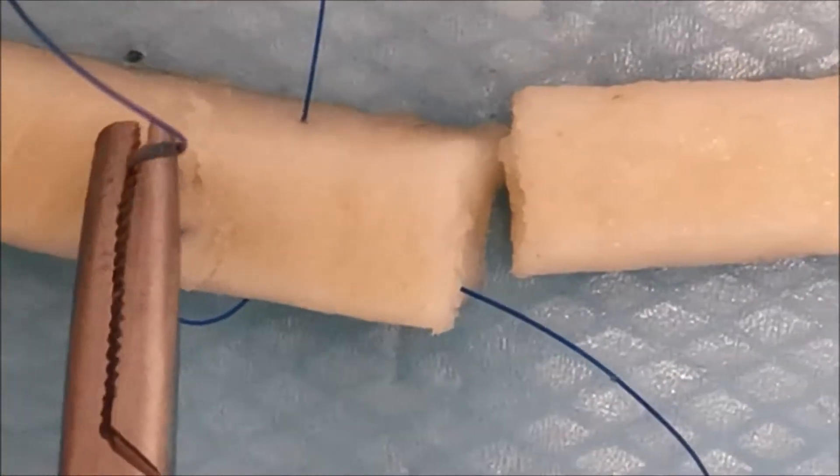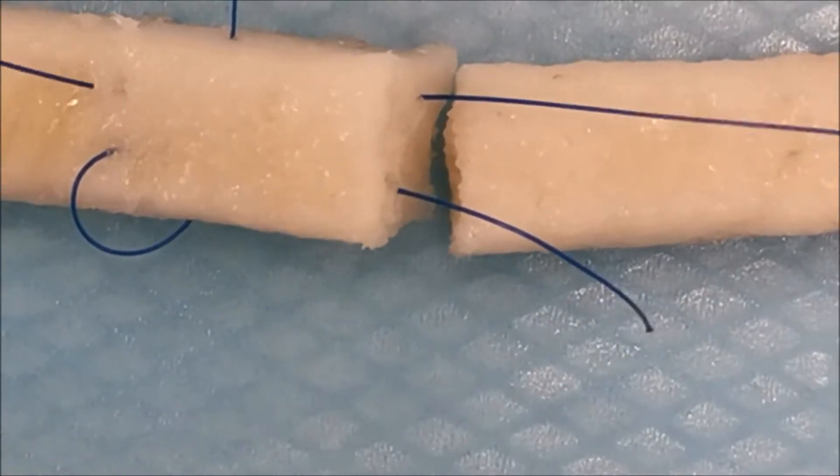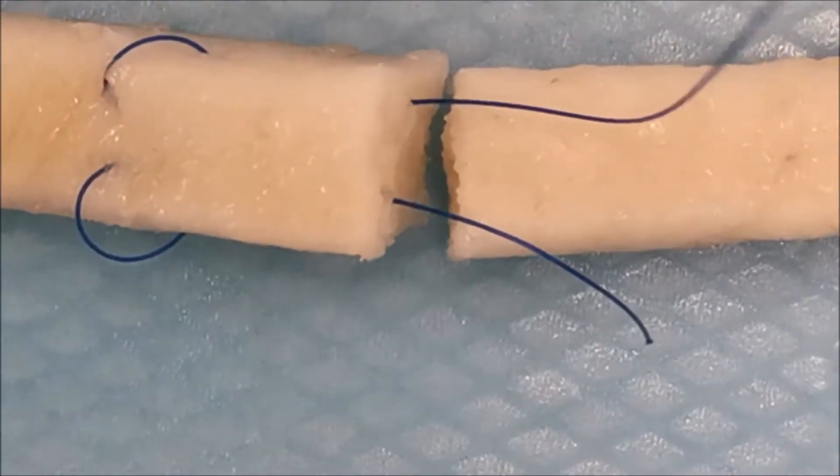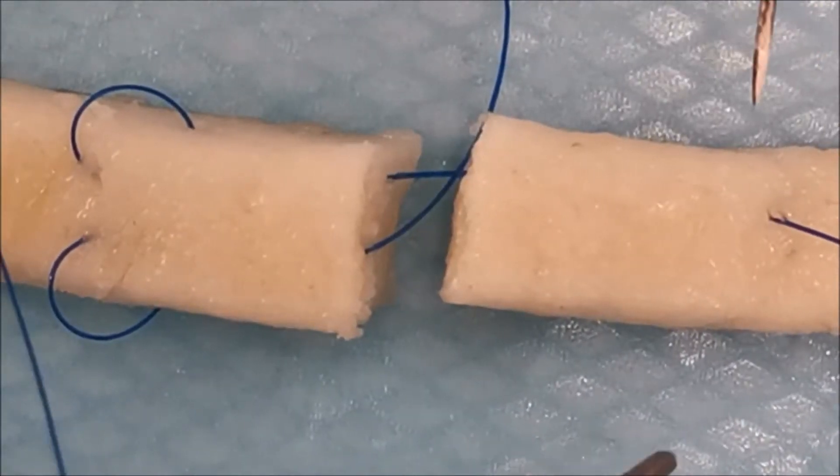The next grasping loop is done by the following longitudinal bite away from yourself, and the same is done on the other end of the tendon.